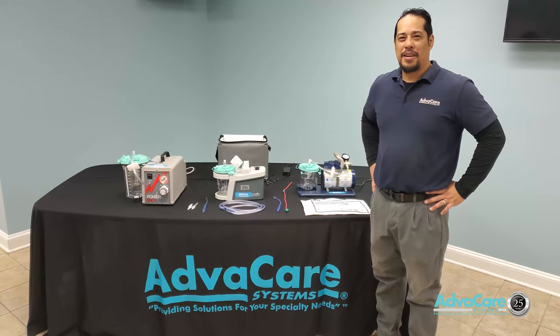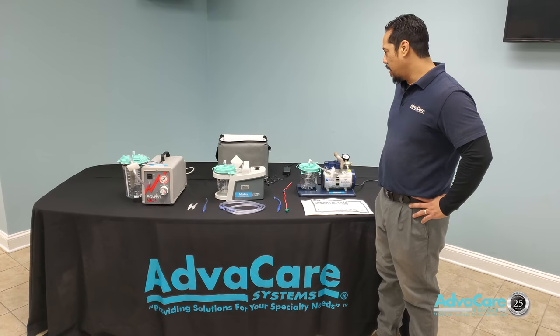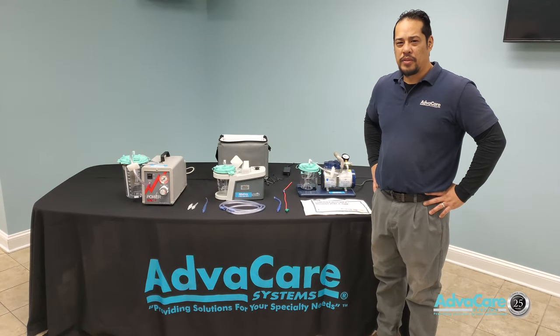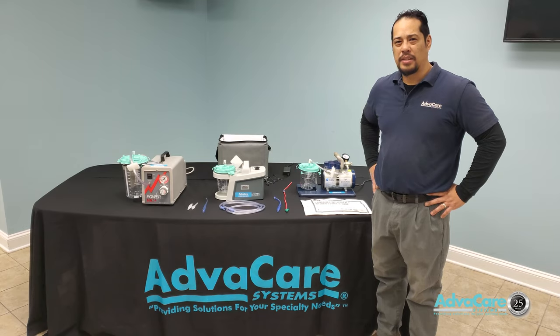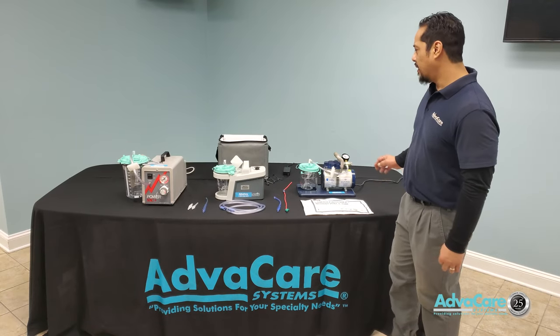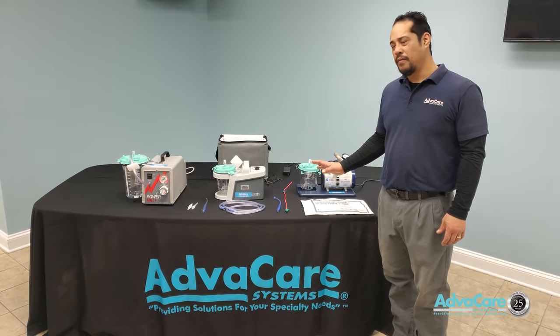Good morning. Today we'll be talking about suction therapy. In front of us today we have three different types of suction therapy machines. Suction therapy can be used to help adequately clear any type of fluid blockage, mucus buildup, upper respiratory blockage, and sometimes drainage from surgical wounds. These are vacuums for bodily fluids.